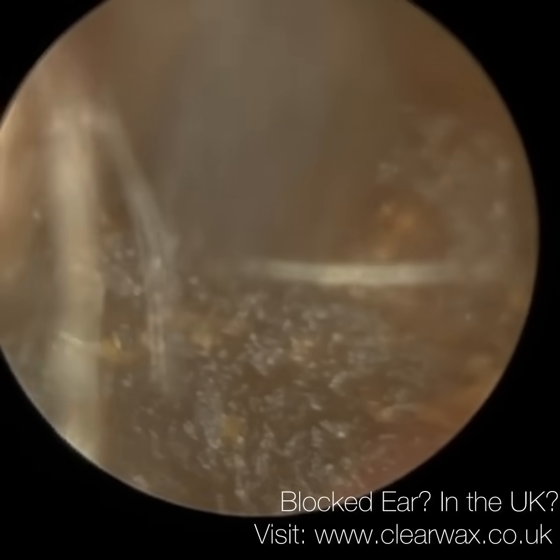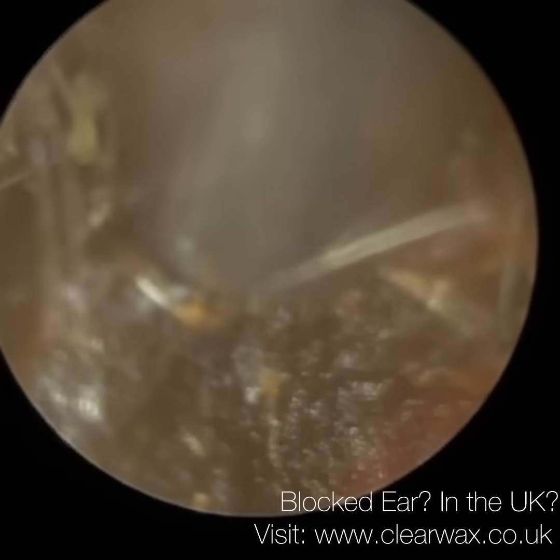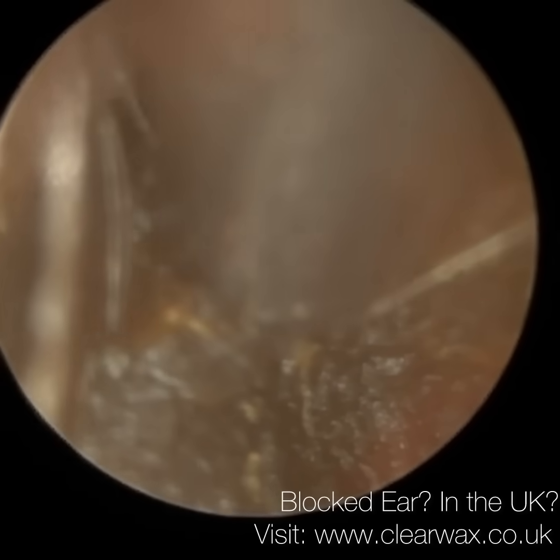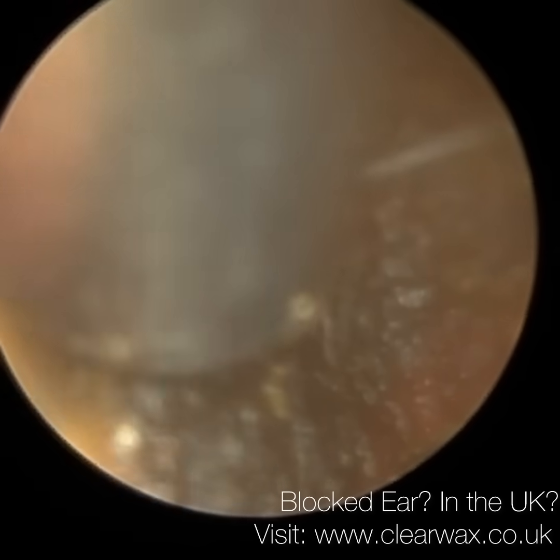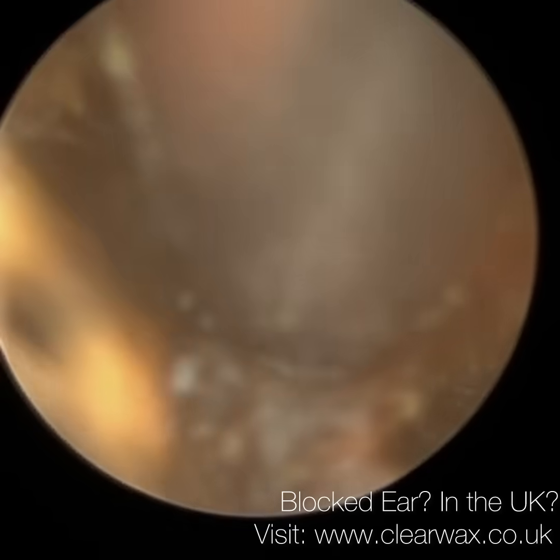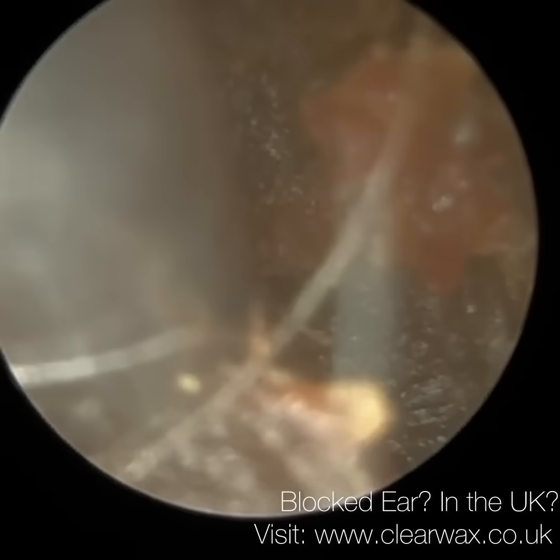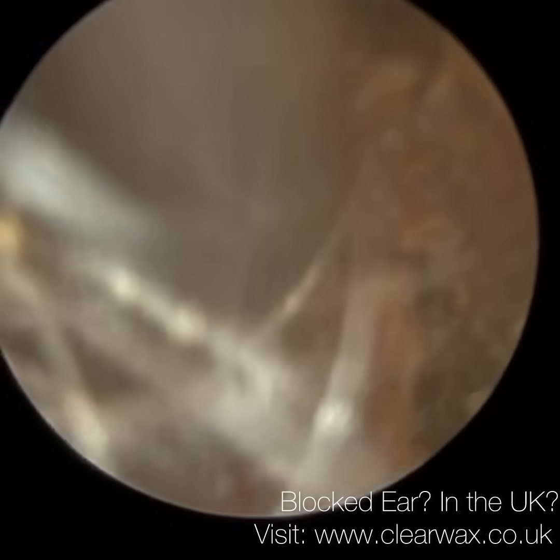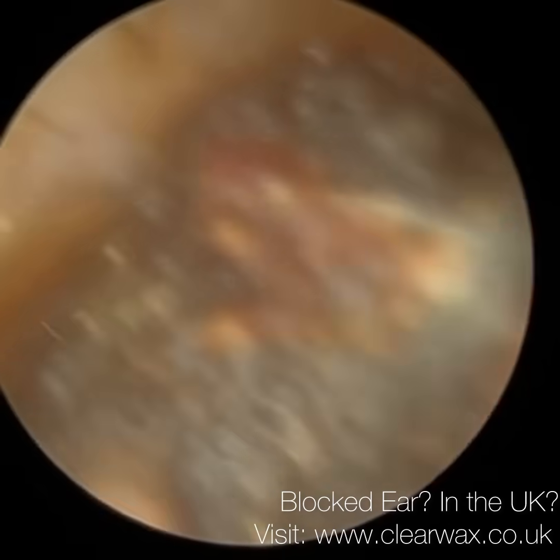Now the consistency of this wax is slightly soft. I think I've used the ear hook already, and eventually I do remove it with a combination of ear hook and the Curette. But with the ear hook, initially it was just cutting through it.